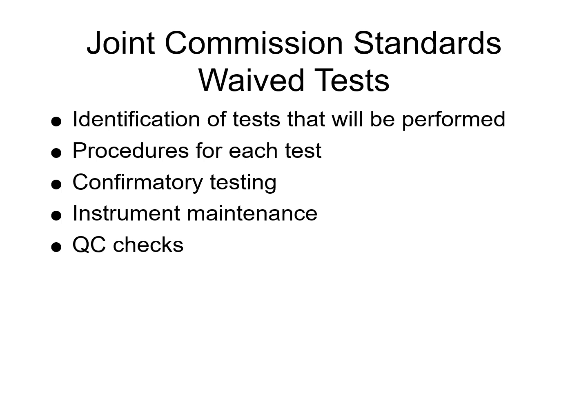For confirmatory testing, some positive or unusual results may actually require confirmatory testing in the lab, and this helps to ensure accuracy and reliability of a critical result. For instrument maintenance, regular maintenance is essential to prevent instrument malfunction and ensure consistent and reliable results. This includes scheduled calibration, cleaning, and service logs. For quality control checks, we're going to perform routine QC checks according to CLSI guidelines. We're going to use controls and standards to validate assay performance and document all QC results and corrective actions if needed.